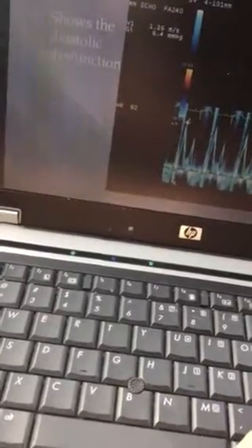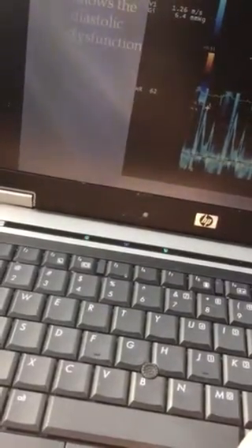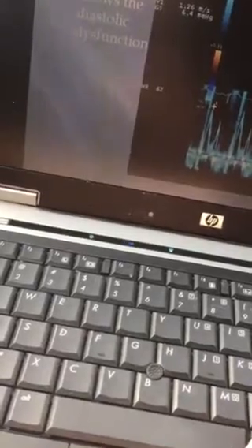And then we have the patient Valsalva, and we get a diastolic dysfunctioning E to A. So the initial E to A ratio looked normal because it was compensated. Now the diastolic dysfunction, when Valsalva, it actually shows the dysfunction. Color in the apical 4 shows this little trace TR. When we measure that, again, it comes out to 41.1, which is similar to what we got earlier.